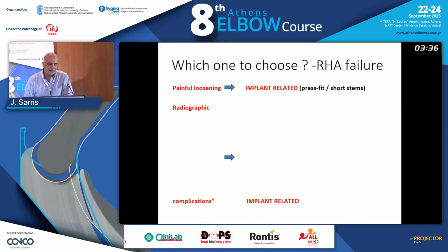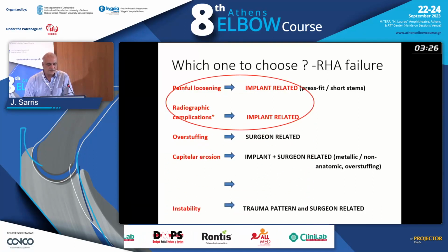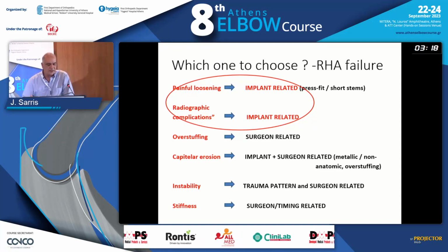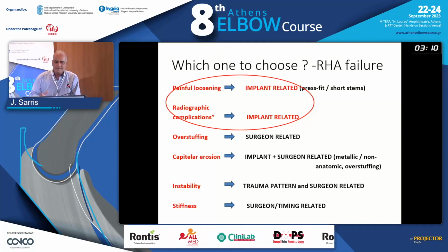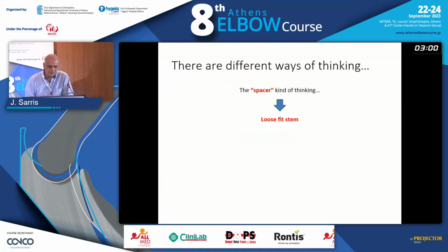So who is responsible for a failure of a radial head prosthesis? Is it the implant, is it the surgeon, or is it the trauma pattern of the injury? We will see that in painful loosening, if we have a loosening, we have radiological complications like stress shielding and bone loss, then it has to do with the implant. But all the other cases are more related to the surgeon and more related to the pattern of the trauma.